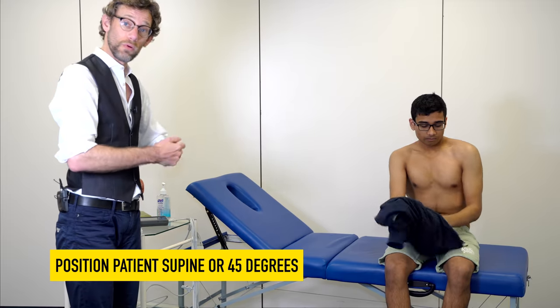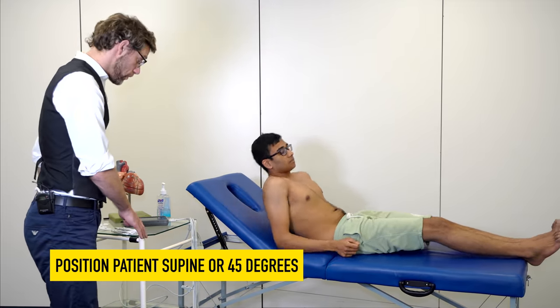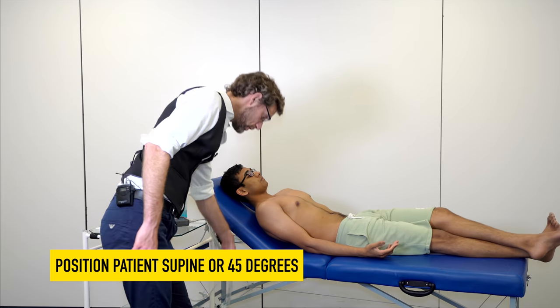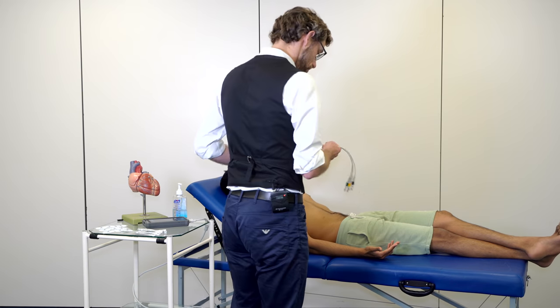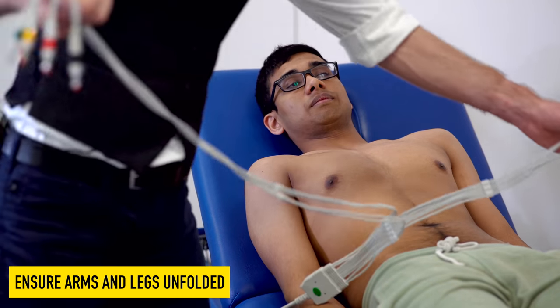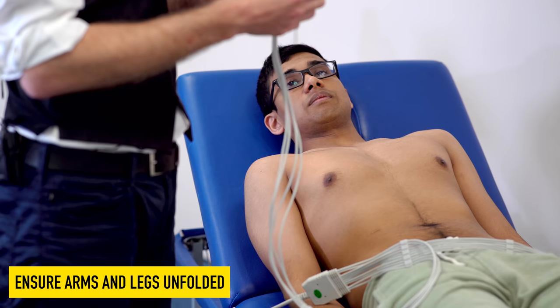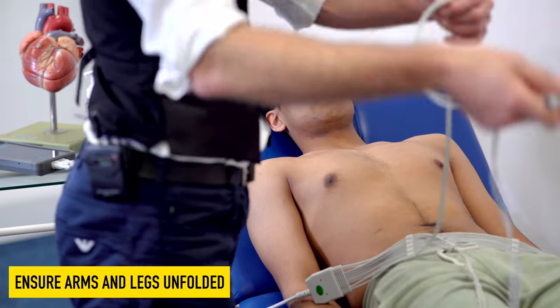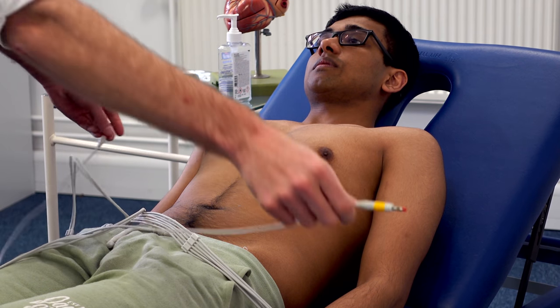It's quite important when you're doing the ECG that you've got the machine on a trolley with wheels so you can bring it closer to the patient if you find that your leads aren't quite reaching. We're going to start off with our limb leads. We're going to move our chest leads across the patient, move our leg leads down towards the bottom, and bring our arm leads to the top.